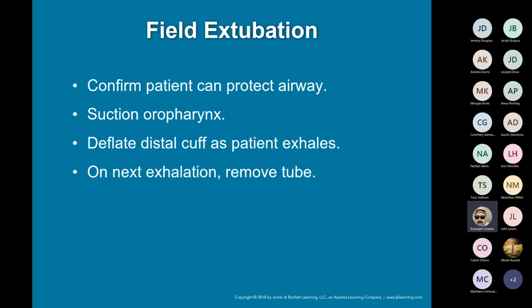I would have suction handy, just for the simple fact that these patients are potentially going to vomit. I know I probably would, but they're saying go with the patient's breathing. When the patient exhales, that's when we should be removing it, not inhaling. If they're inhaling, we're essentially fighting ourselves then, right? And we're taking air away from the patient.